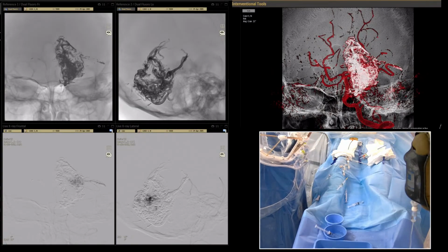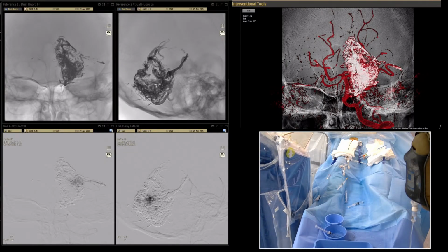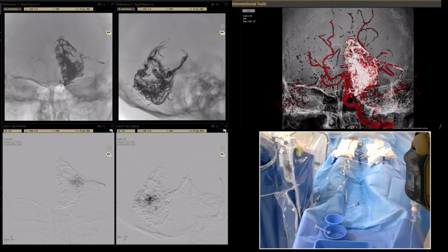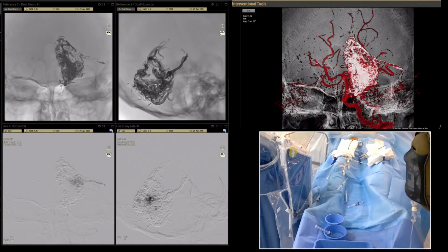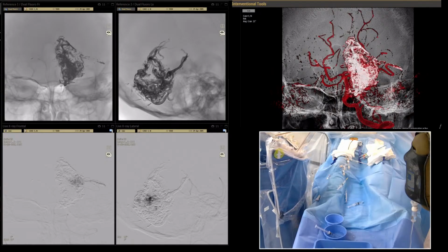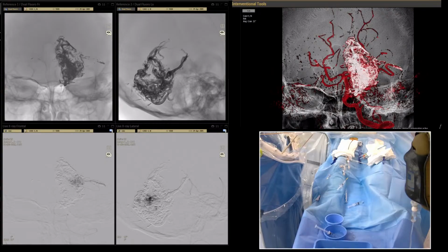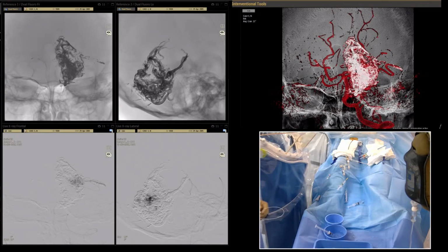Rowan is a neurosurgeon. He said, okay, let's place one more. Okay, optimal 1.5 by 3. Helical super soft 1.5 by 3. It's another of the best coils in the world. Yes, the whole material presented in our cat lab in the Angio Suite is the best in the world.